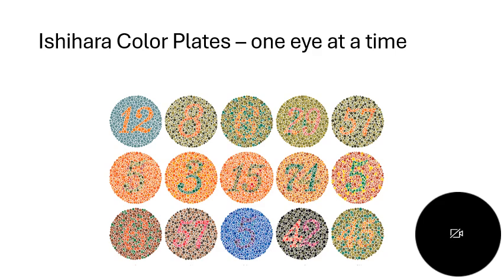And this can be used to assess color vision problems, and also if someone has damage to their optic nerve, their color vision will be affected. You will notice that in one of the subsequent lectures. There are multiple numbers and you check how many of these plates the patient can read correctly.